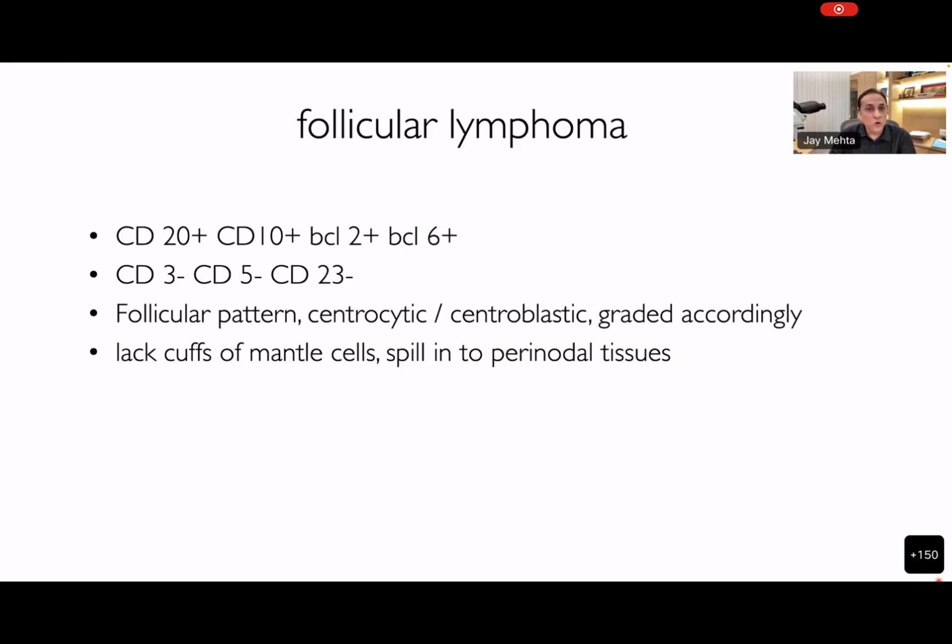From there, going on to follicular lymphoma. As the name suggests, it's the proliferation of follicular spherical structures. By definition, it will mark with CD20, will also express the follicle germinal center markers CD10 and BCL6, and BCL2 is positive in follicular lymphoma. Remember, BCL2 is only of use in follicular lymphoma in the small cell lymphoid evaluation. The follicular lymphoma cells are negative for CD3, CD5, and CD23.